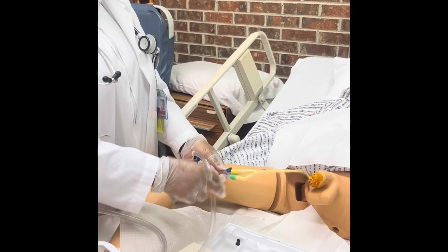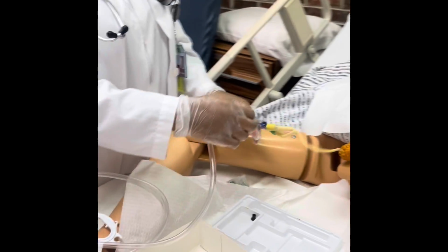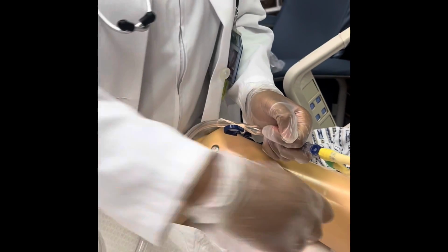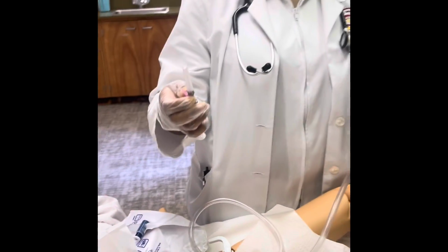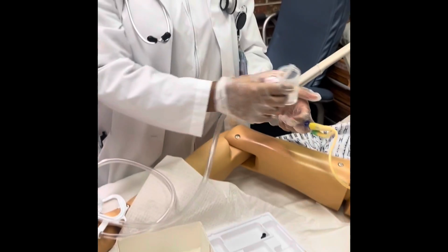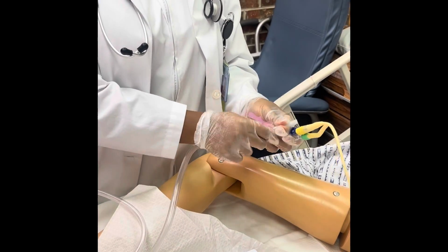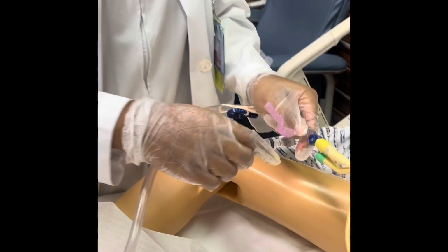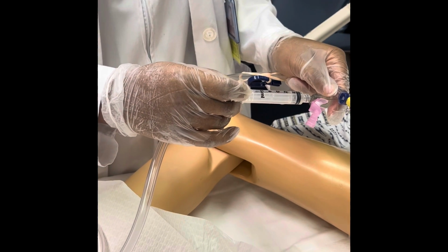Now I'm going to be pulling the urine from this port. I'm going to clean with alcohol. Let that dry, trash it. And then I'm going to be using this syringe. It has a detachable needle. And I can go ahead and open my urine cup. Be careful. Insert the needle. Pull out 30 milliliters of urine.